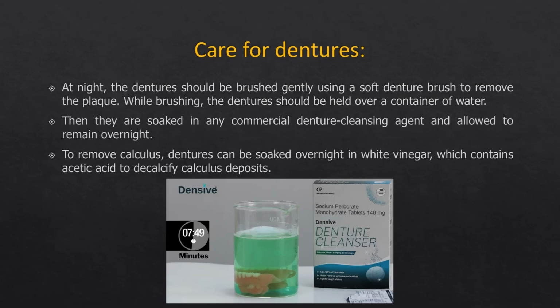You also need to give care instructions, like hygiene is of paramount importance. The dentures need to be brushed and cleaned every day, just like you would your natural teeth. But the difference is that dentures should be cleaned with a soft denture brush and not a hard bristle brush, and not with toothpaste, but with a mild soap, liquid soap, or soap wash. The dentures should always be cleaned thoroughly with water, and preferably a cleansing agent such as denture cleansers.